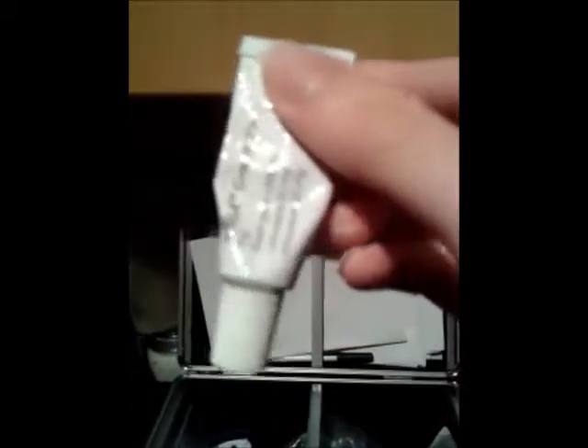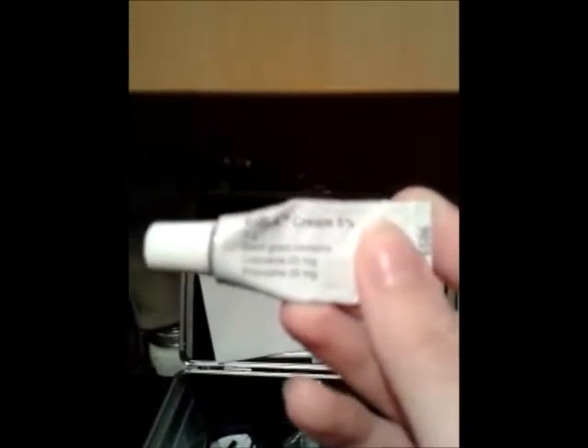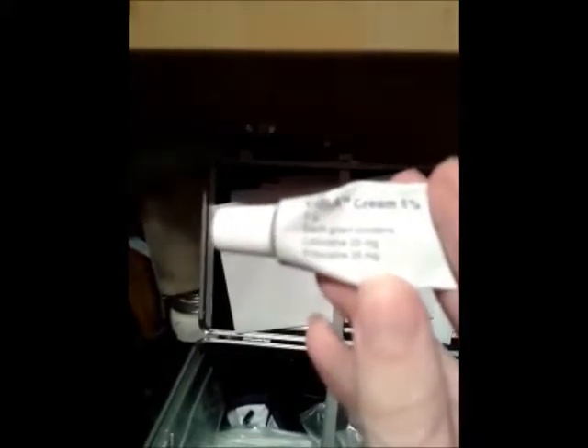One thing I put on about an hour before I infuse is this Emla cream. You want to get it in tiny packets, but this will help numb the area. So if you do find it painful when you have to insert the needles, like I do, this is a lifesaver. It's made up of lidocaine and prilocaine, and it really does work.